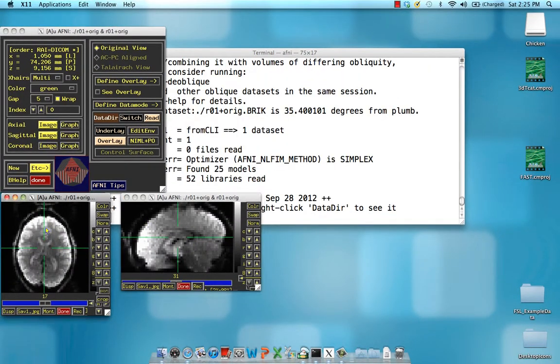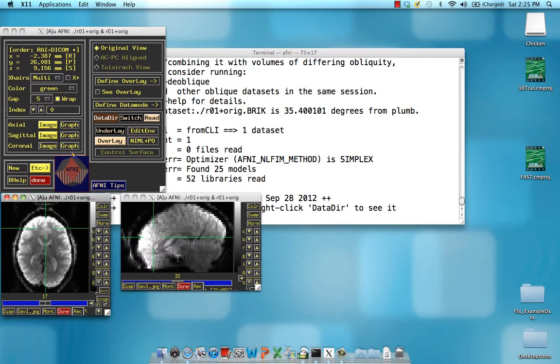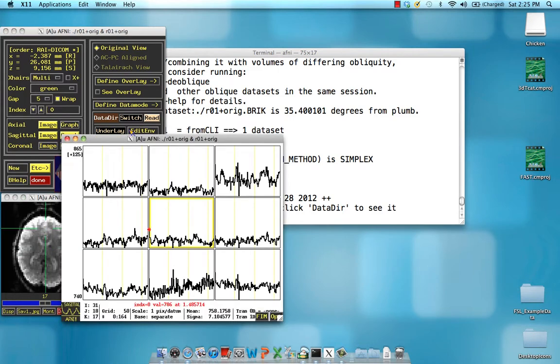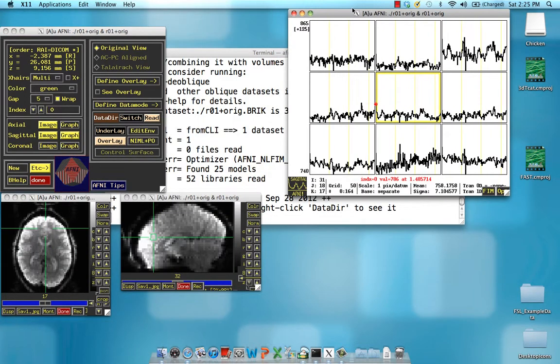So first of all, it looks like a normal functional data set. It's a little bit blurry. And if we click on this graph, we can see the time series data, which also looks pretty normal.